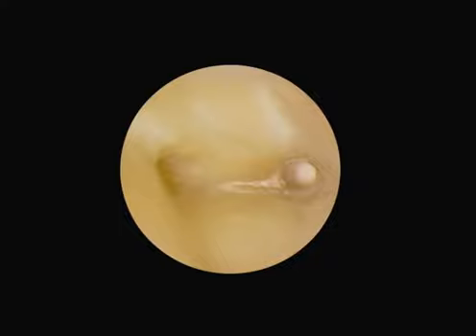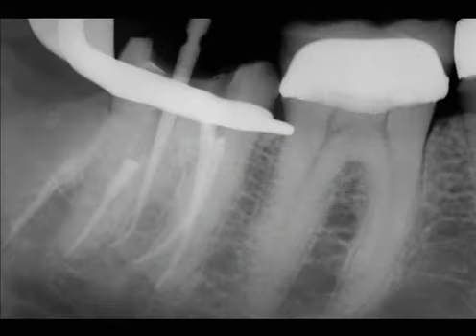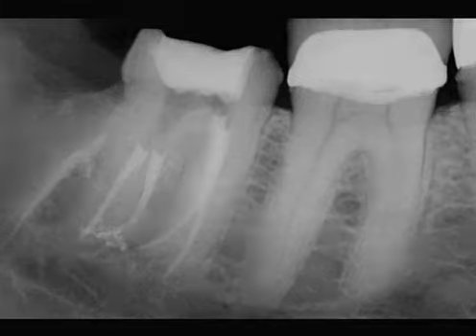A photograph at 15 power shows a second distal lingual system. Notice the white line between the treated DB and DL orifices. The photograph at 15 power shows access to a shaped distal lingual system, a cleaned out isthmus, and the previously treated DB system. A working film shows a size medium master cone at length. The post-treatment radiograph demonstrates the packed DL root canal system.